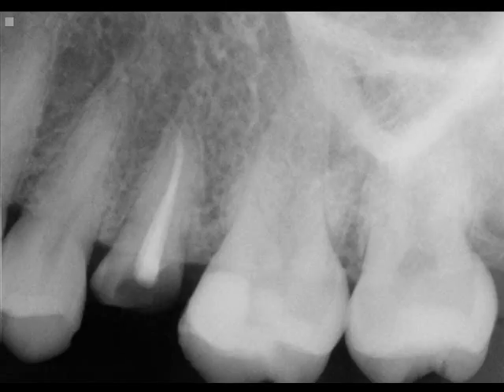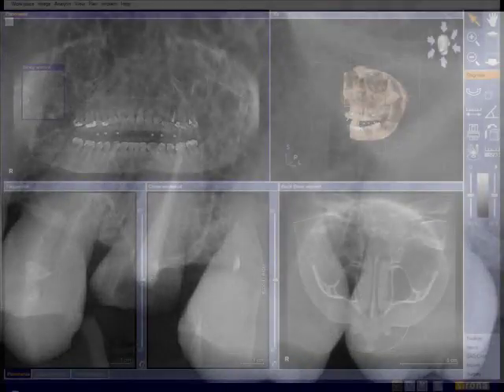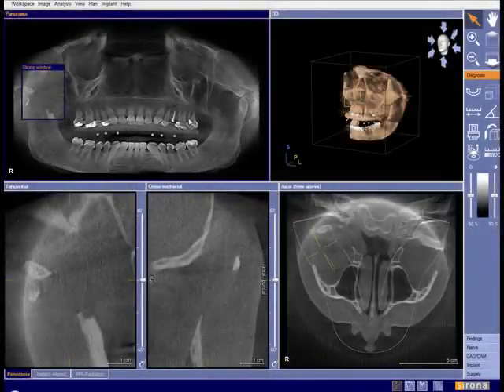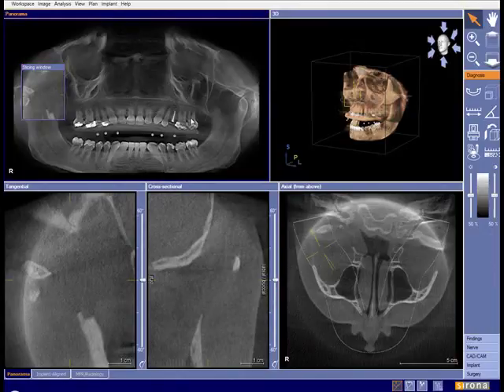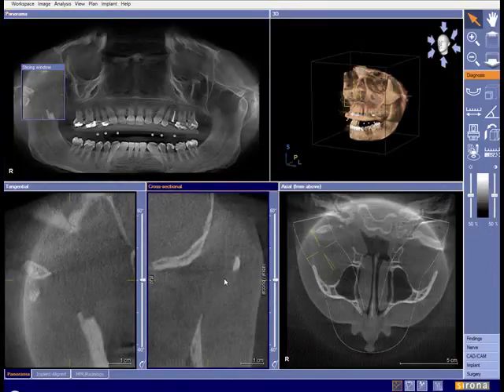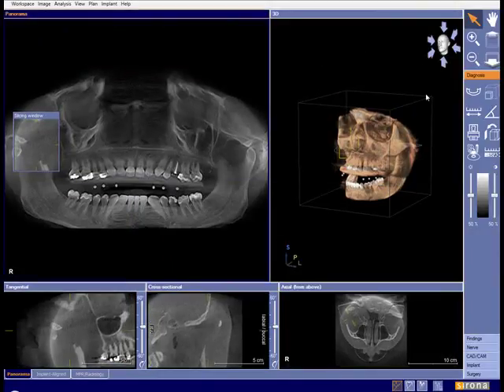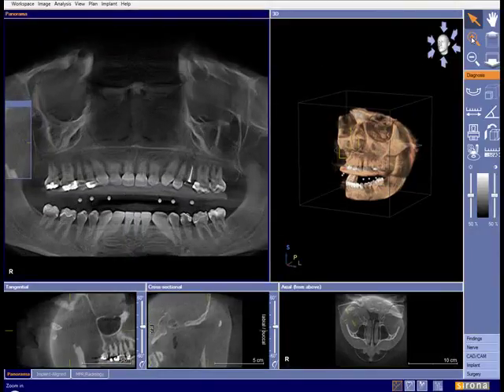We're going to do this all in three dimensions. Instead of this conventional x-ray, I'm going to take an x-ray of the patient's jaw. This is in the upper left area. The primary concern for placing an implant into the upper jaw is you don't want to be anywhere near the sinus.